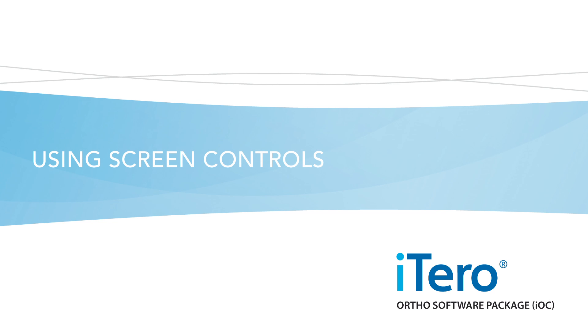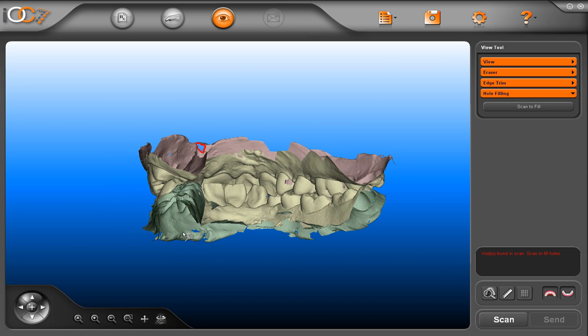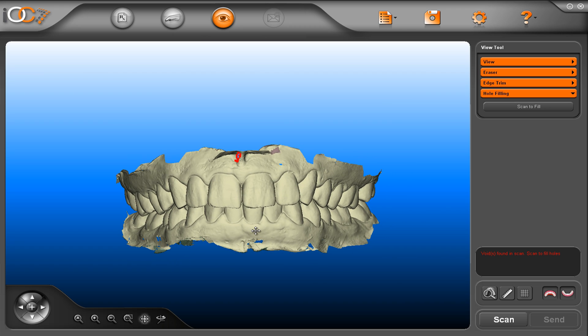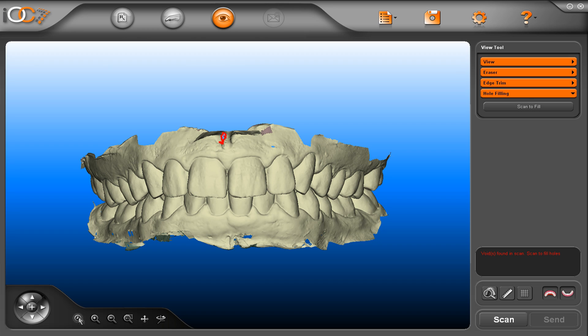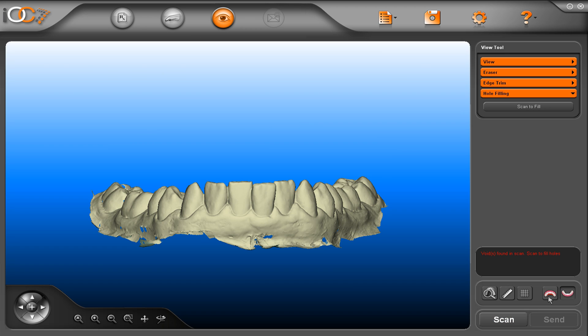Using screen controls. You can manipulate the model using the mouse and the screen control panel. You can rotate the model, pan up, down, right, left, zoom region, zoom out, and zoom in. To put the model in the centre, press zoom all. You can also control the model movement using the control buttons. Click on the plus button to centre the model on screen. Press the jaw icon to show and hide the jaw, allowing you to separate and view each jaw individually, including checking the lingual side for missing data.